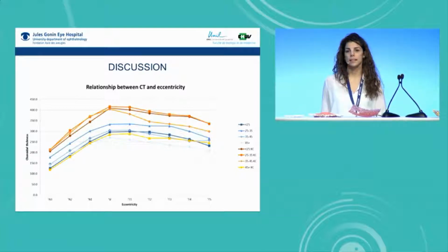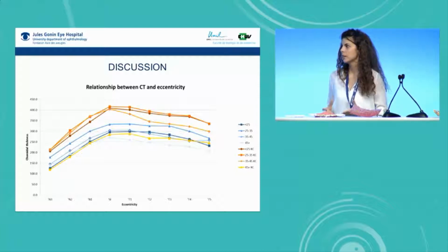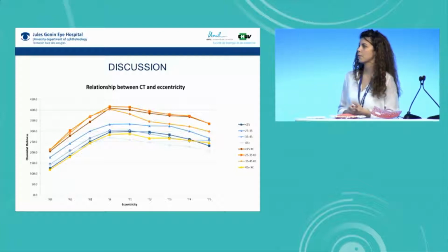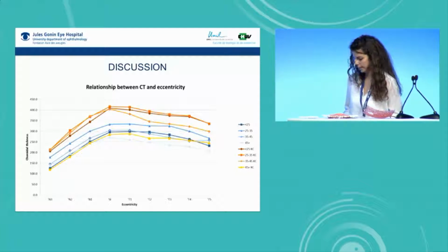But this theory cannot fully explain our results, because we have already seen that those patients older than 45 have an almost normal choroid. So if we've got a collagen alteration, we would have an alteration in the choroidal thickness profile that is stable with age, or even worse during the time.